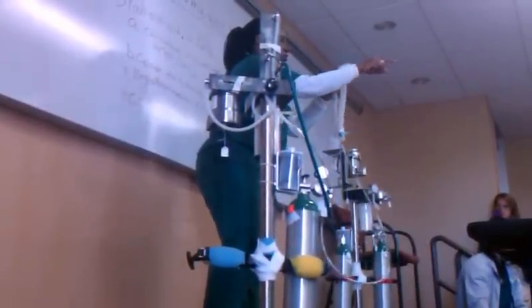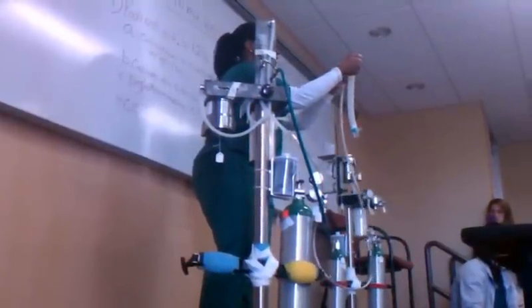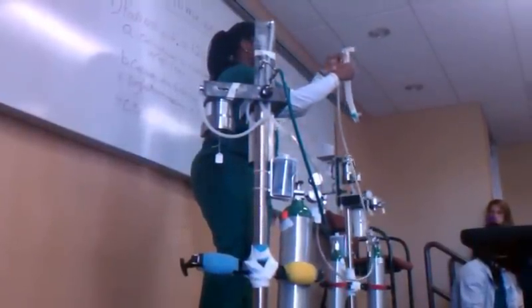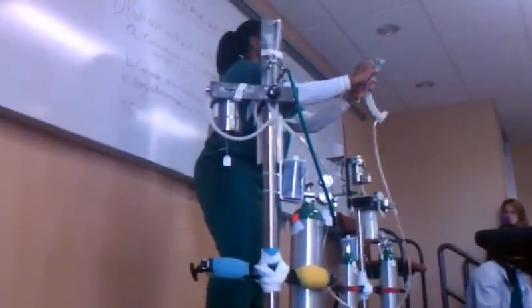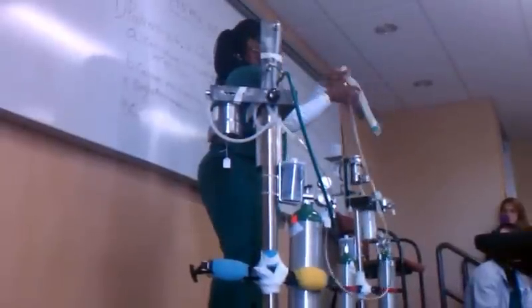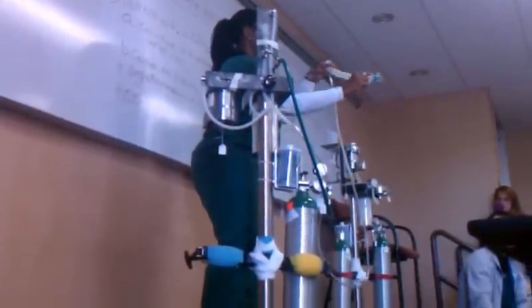This is where the patient would be — the endotracheal tube. When the patient exhales, the exhaling gases are going to go through this clear tube. As you can see, there are some parts missing here. Exhaled gases go through the clear tube.